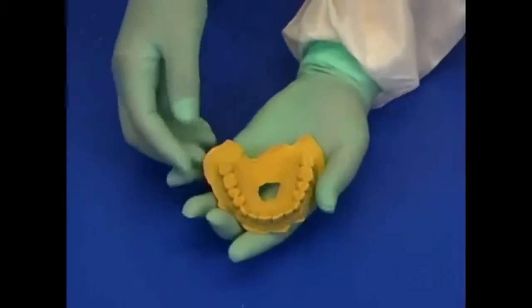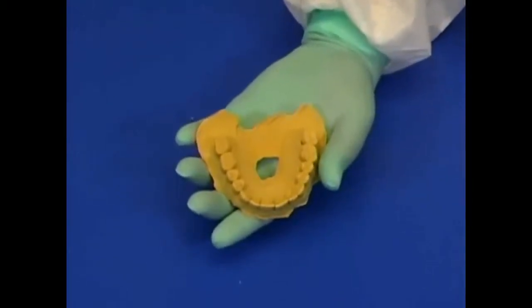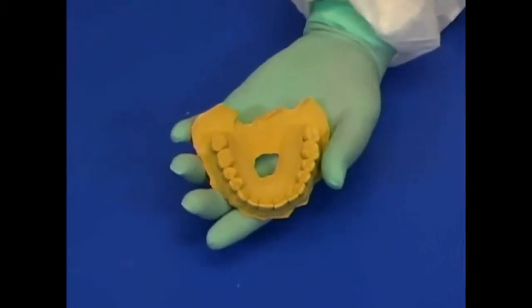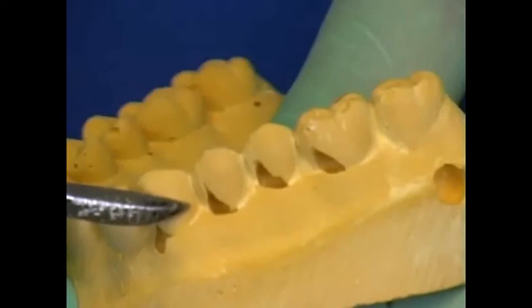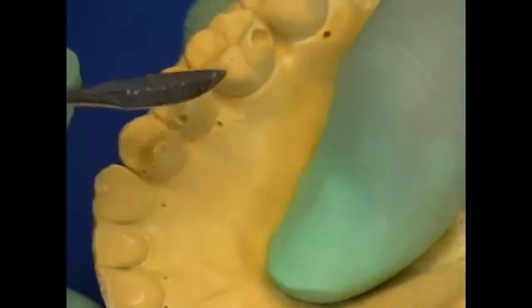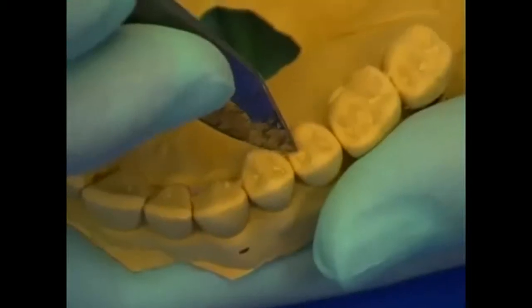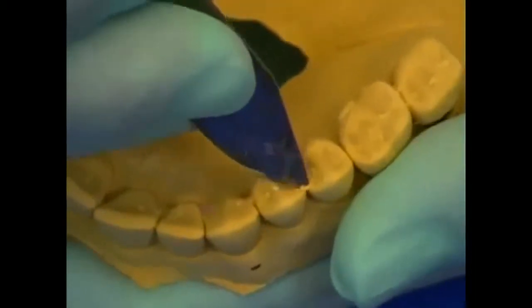Inspect incisal and occlusal edges for voids and excess blebs of stone. Air bubbles incorporated into the stone during pouring will result in voids in the final stone model. Remove blebs of stone with the lab knife.